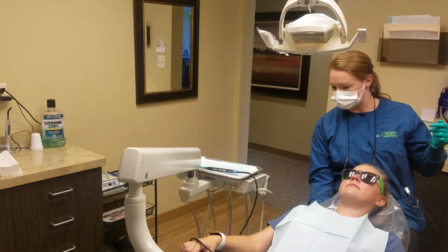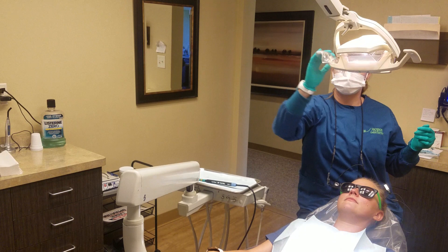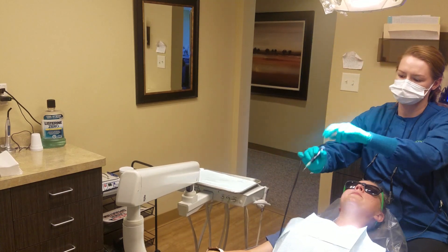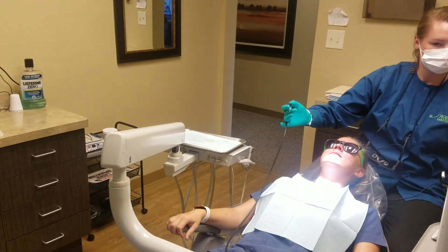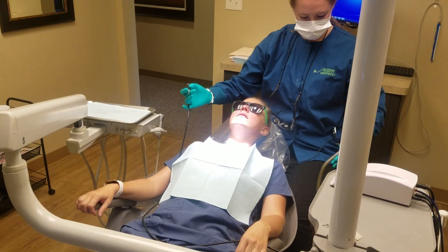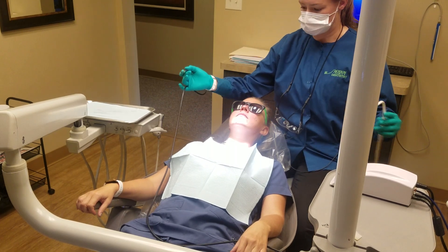So I'll go ahead and show you on Kelly here. It just runs right along the gums and goes right in between the teeth. And we use the suction to take the water out that the Cavitron is squirting in.